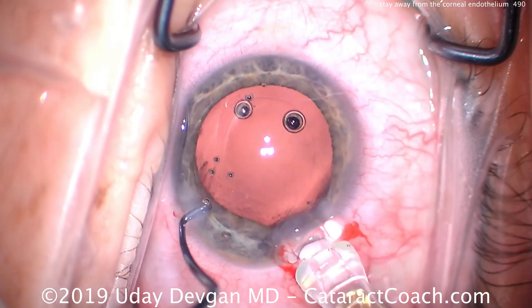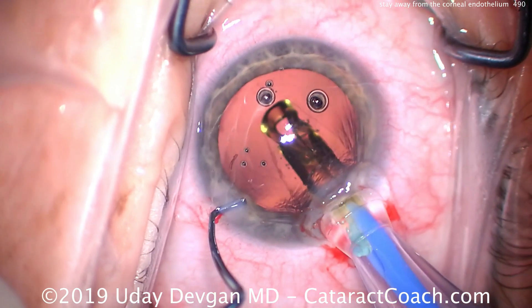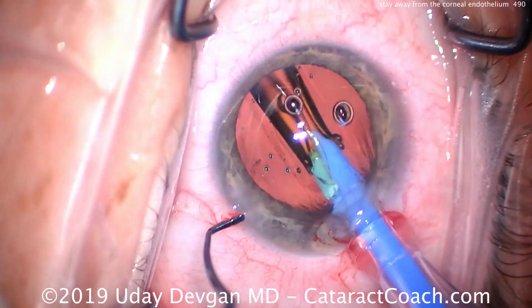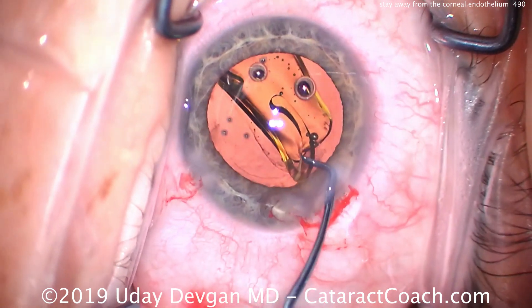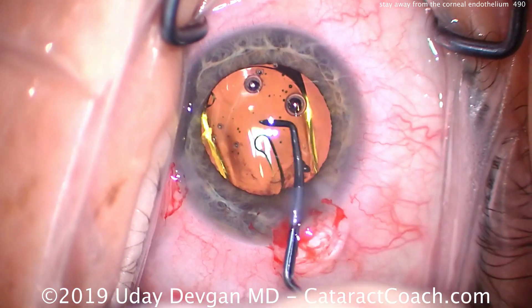Now we'll put the lens in the eye and complete the case. At the end of the case, in our viscoelastic removal mode on our machine, that's not only high vacuum but high flow, so that flow of balanced salt solution within the eye is going to wash away the viscoelastic that's stuck on the cornea.